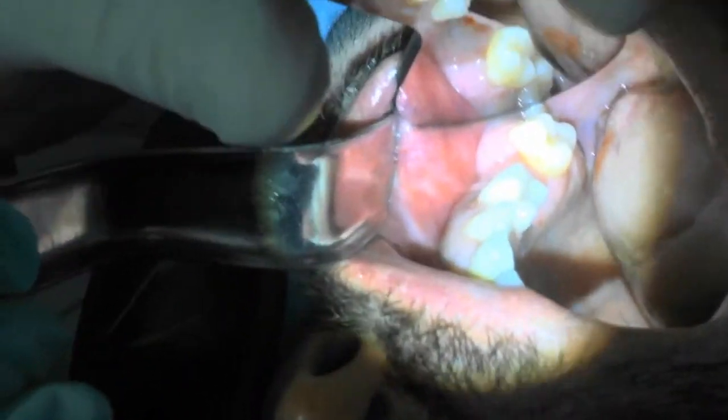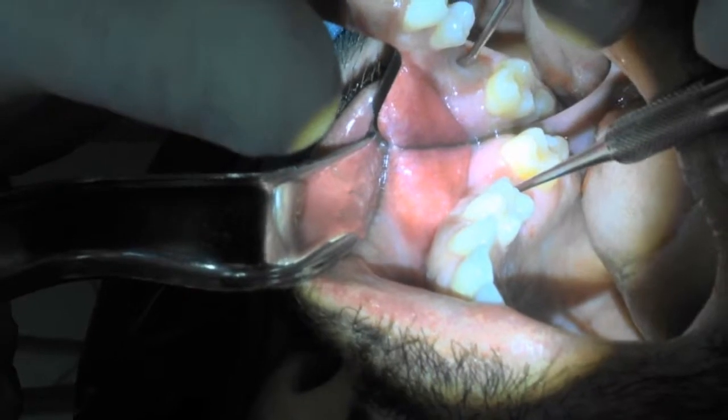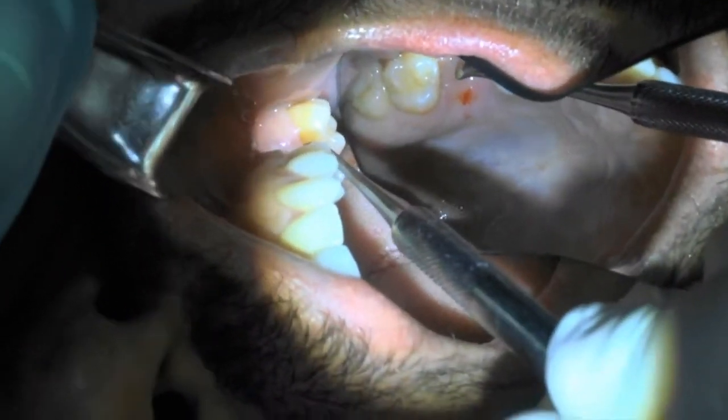If you would hold this for me. Yep, thank you. What I'm talking about, if you take the retractor, I'll hold the mirror. There we go, perfect. What I'm talking about is this area right here. I'm going to bring this buccal by what I'm doing with my osteotomy right here in the middle. If I go back to this view and understand what I'm doing, I'm going to move that buccal flap just with pressure, with pushing, after I create the osteotomy. I think it'll be something cool. If you don't do stuff like this, it might be something that you want to adopt.